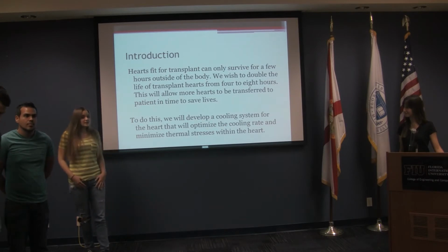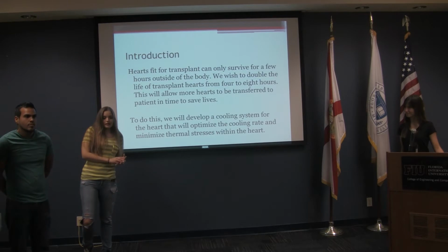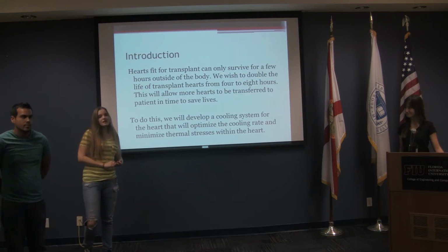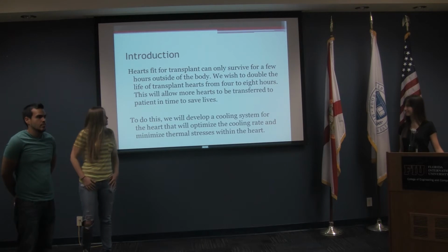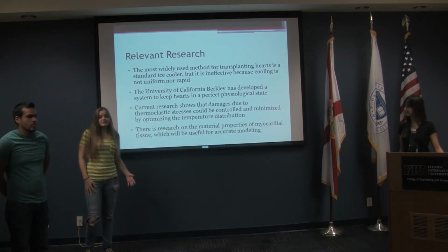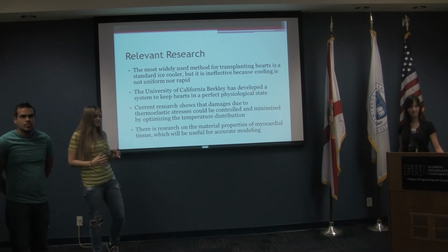The current way of doing this is to just use a standard ice cooler. And while this is cheap and easy to produce, it's not as effective as it could be because it's not uniform nor rapid enough. So, University of California, Berkeley has found a way around this by developing a device that keeps the heart at near perfect physiological state.